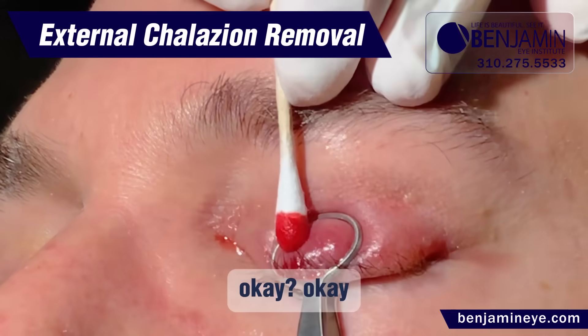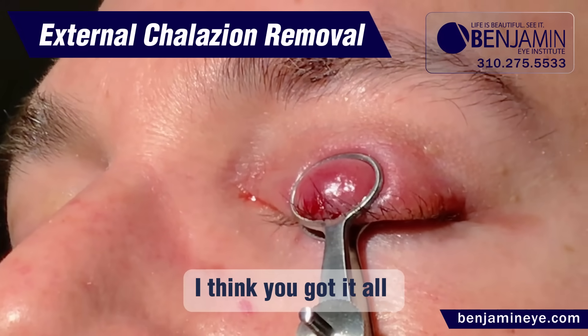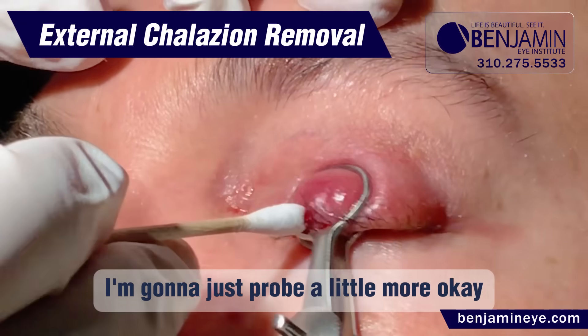Okay, I think we got it all. I'm going to just probe a little more.